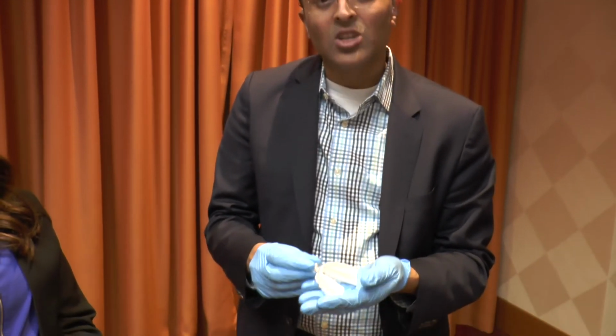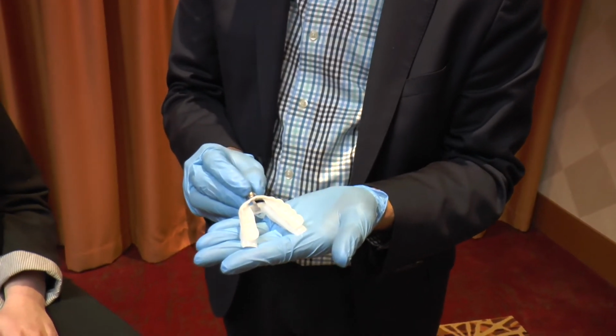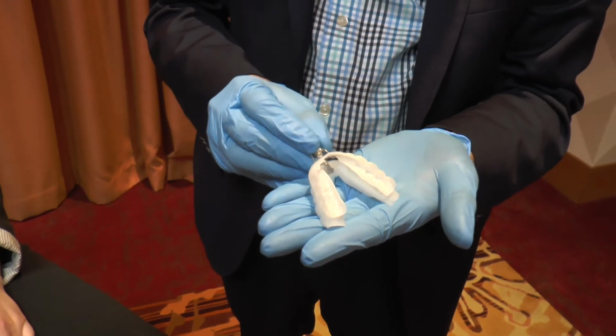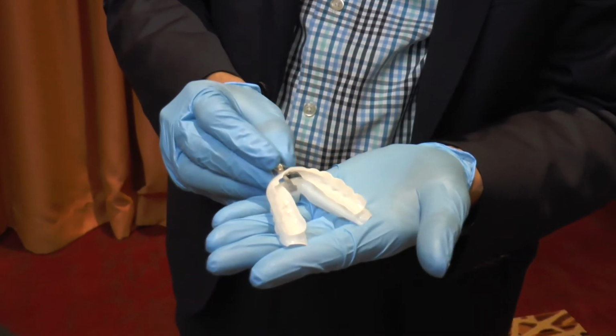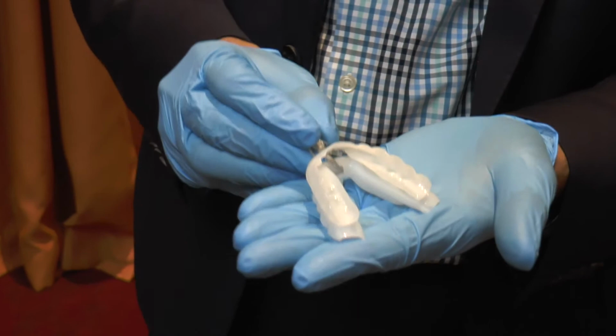Do remember, this is a trial device. The idea here is to use the device to see if it's going to be of any benefit for the patient to consider custom oral appliance therapy, and therefore the intention is not for long-term use. It's been recommended that this device be used up to 4 to 6 weeks, with a few exceptions.